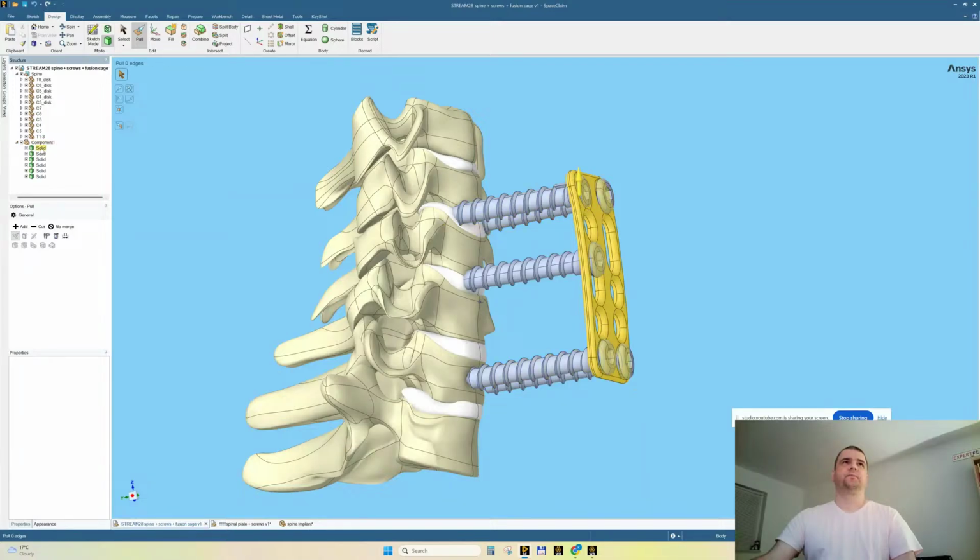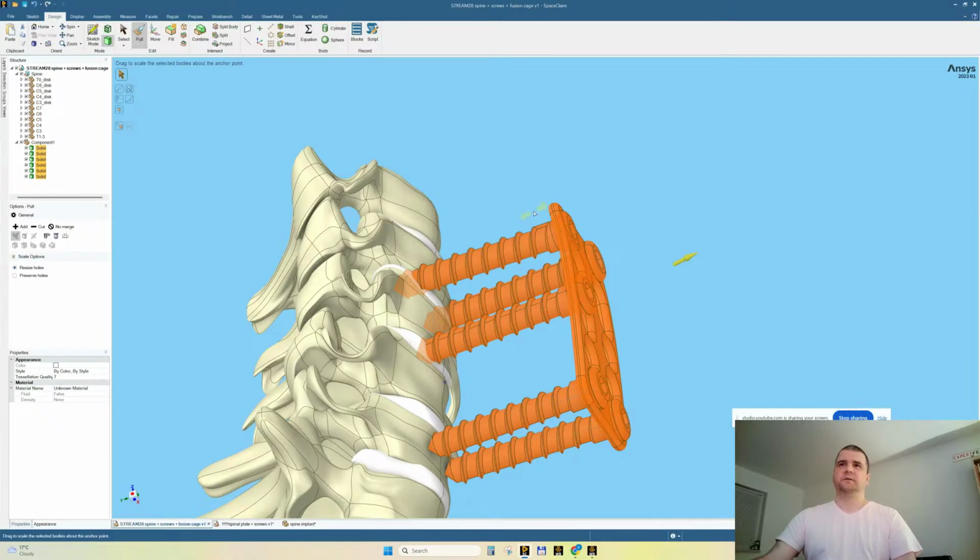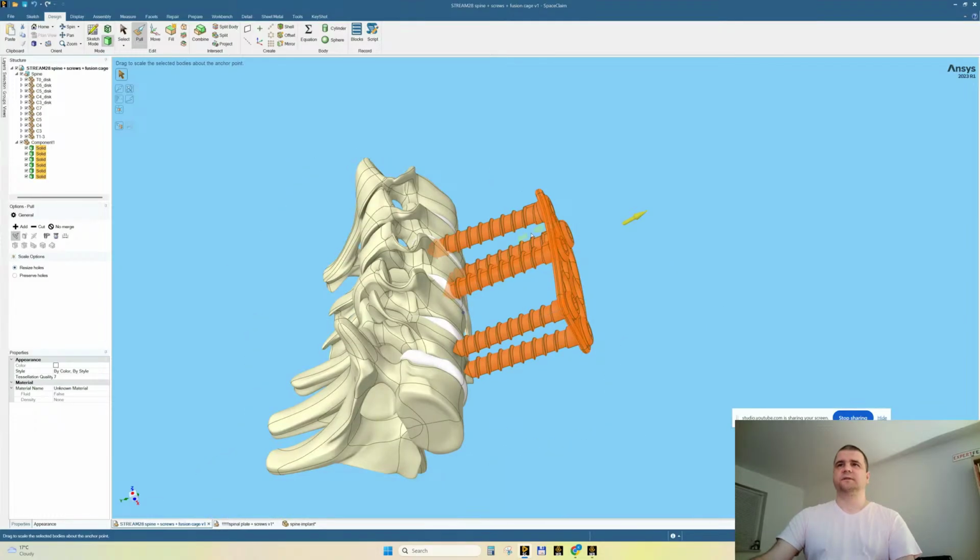Let's see. I lost it. So I triple clicked to select a solid body, yes? So let's triple click the other parts, but with Control pressed. No, we don't need a triple click, we need just Control pressed. They kind of know that we have solid bodies. The software knows, so it's pretty easy.